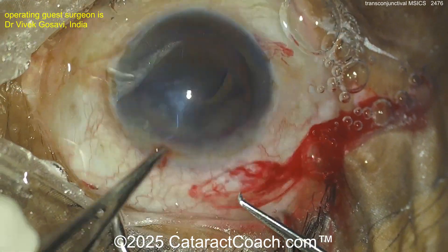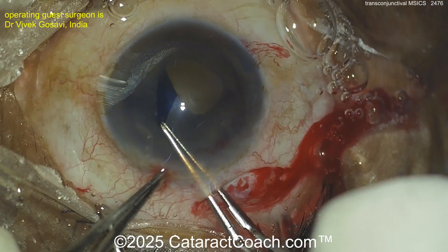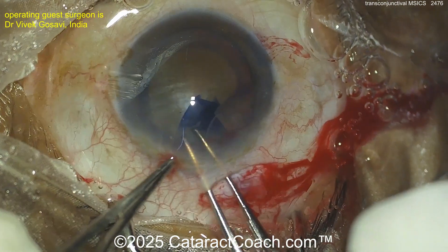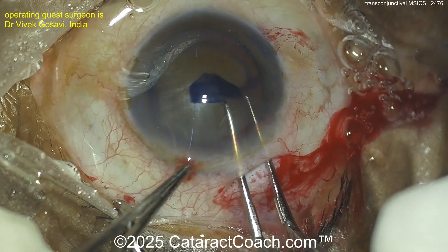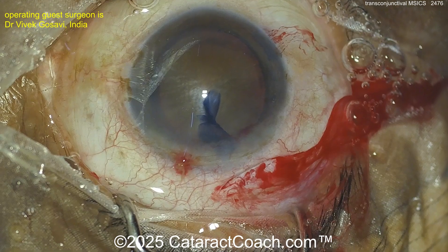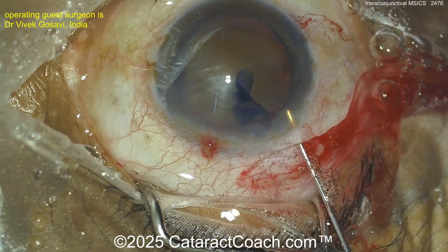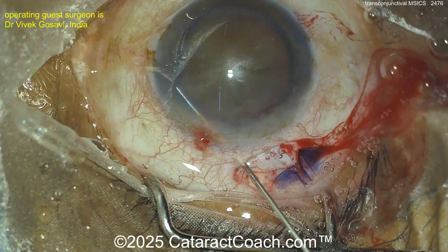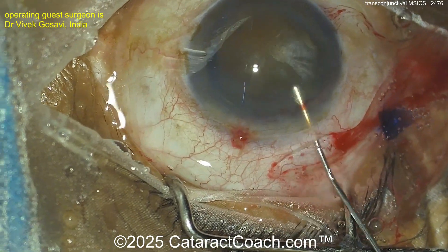Now going to make a nice juicy rhexis here with the forceps — grabbing that capsule — yep, a nice generous capsule rhexis. MSICS is performed very commonly in other parts of the world; in the US it's still relatively rare. Most US residency programs are actually not teaching their residents how to do this, and many surgeons in practice are not familiar with the technique. But you can learn — there's a video on cataractcoach.com — search 'best pearls' — my four pearls for learning MSICS.